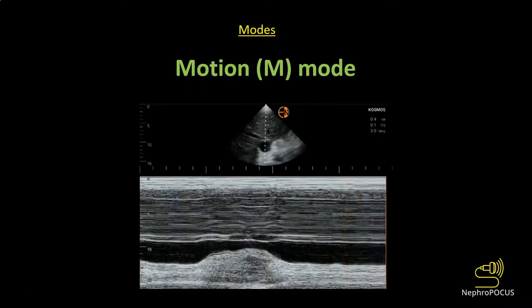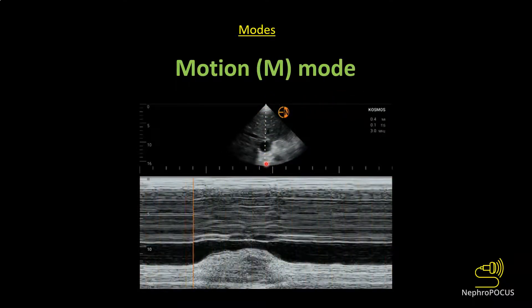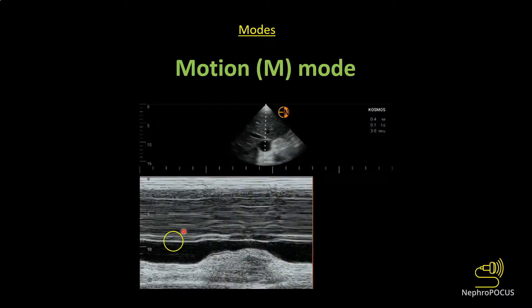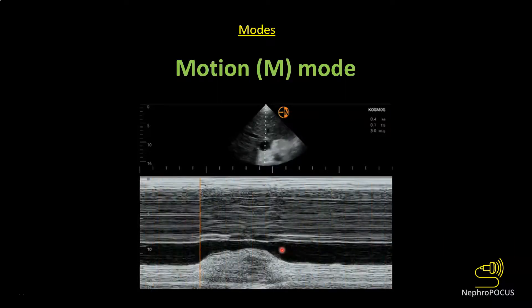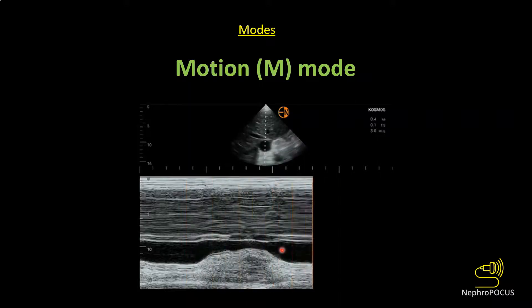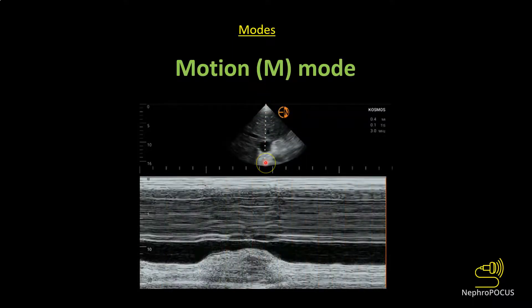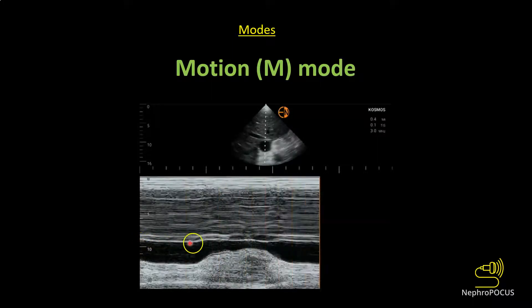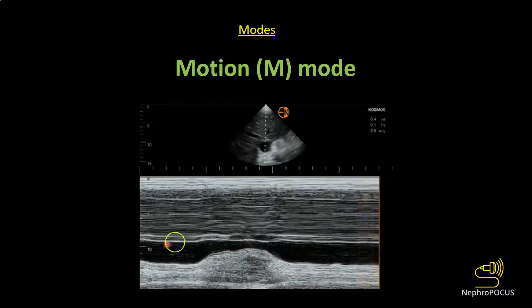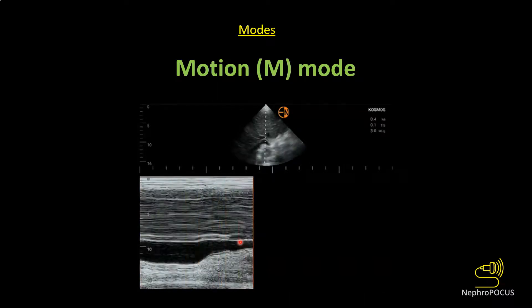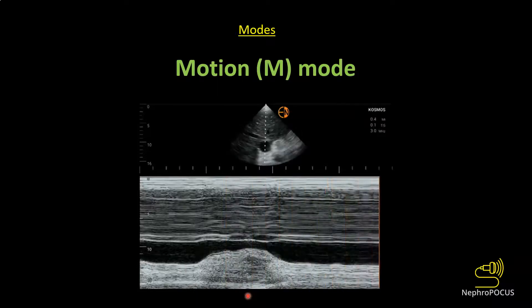The next mode is M-mode or motion mode. You place a cursor on a moving structure of interest, and it generates a tracing that plots movement over time. For example, with an inferior vena cava in transverse axis, the M-mode cursor passes through the middle of the vessel. The widest diameter represents the IVC during expiration and the narrowest during inspiration, allowing you to calculate the exact percent collapsibility.